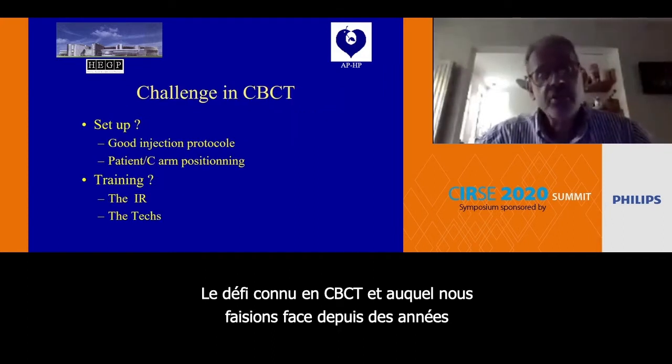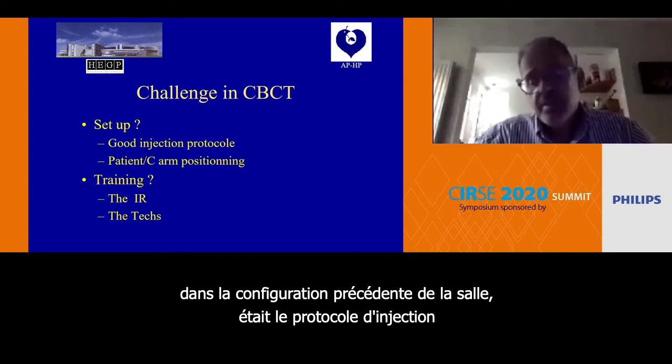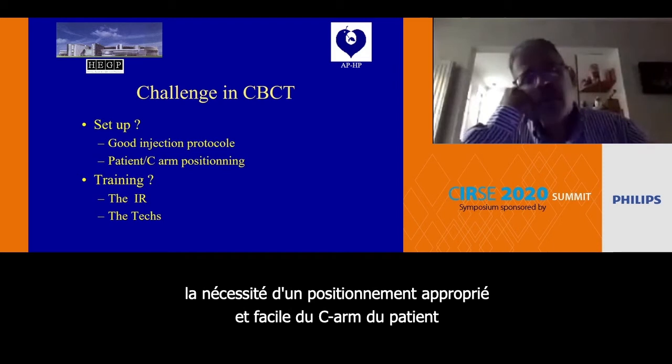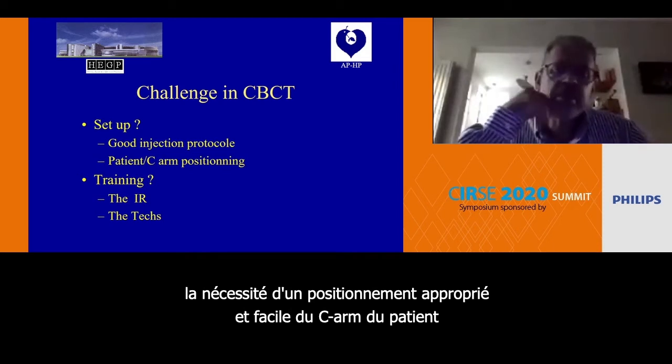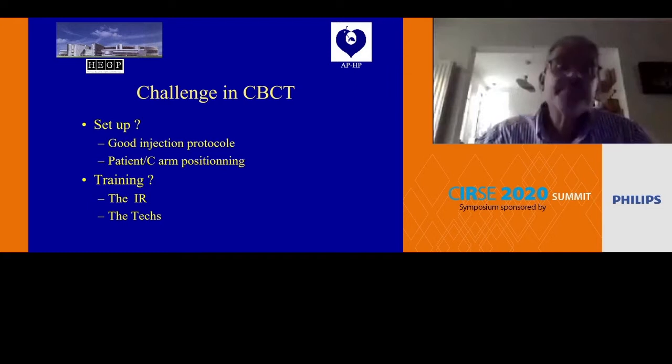So the challenges in cone beam CT that we know and we have been facing since several years in the previous setup of the room were the injection protocol, the need for appropriate and easy patient and C-arm positioning, and also problems related to training of the IR and the techs.